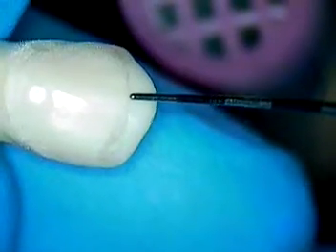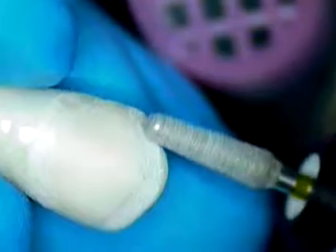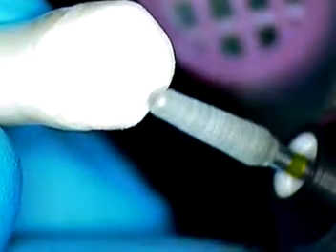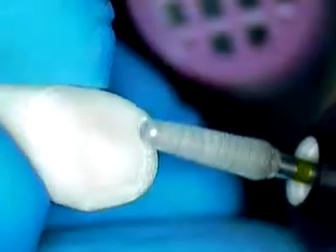Let's measure the anterior segment — the incisal ledge. We want about one and a half to two millimeters of reduction, so we'll score that at 1.5mm. Now the question is: do I just go ahead and reduce the incisal the way I did the back teeth? For this exercise, we're going to leave it to last. Let's see what happens first when we walk through our planes of reduction.